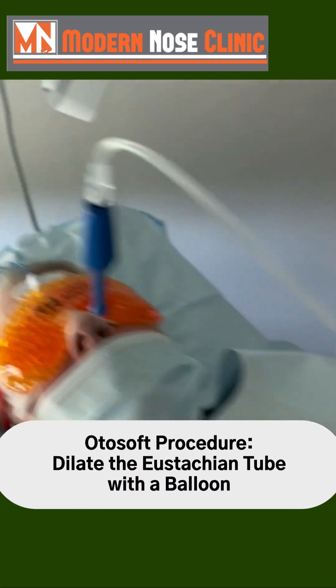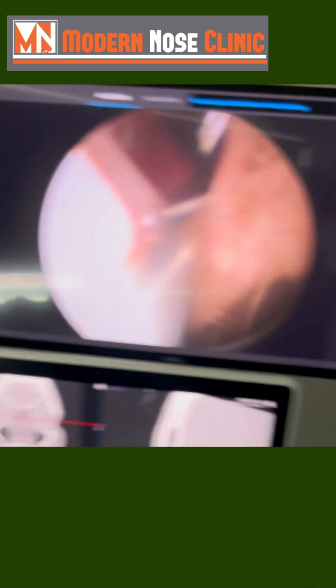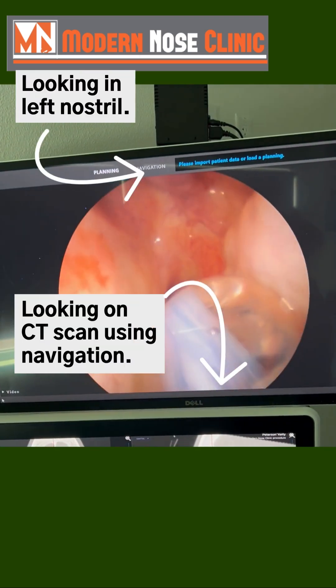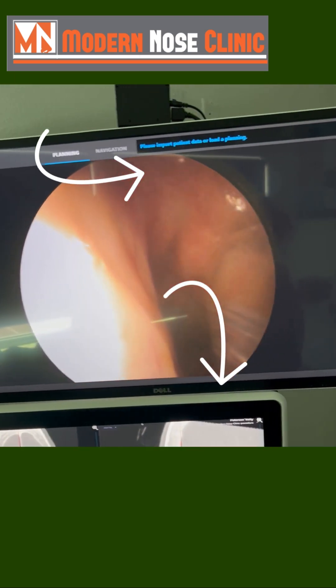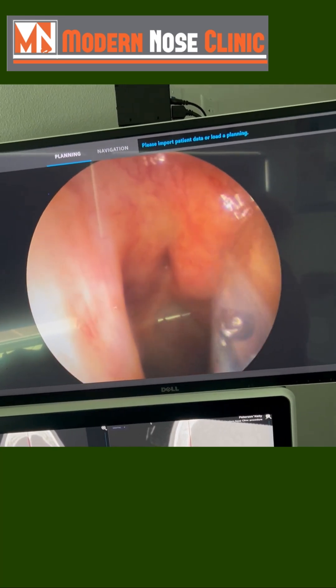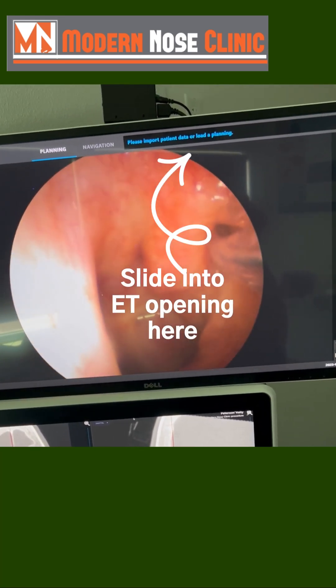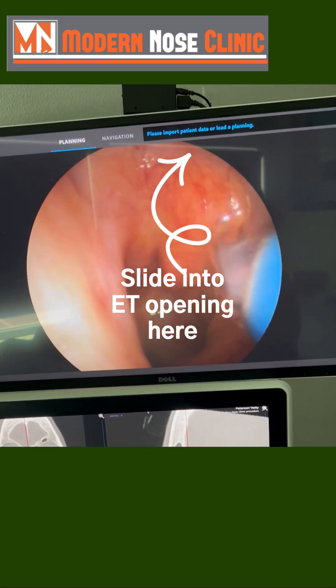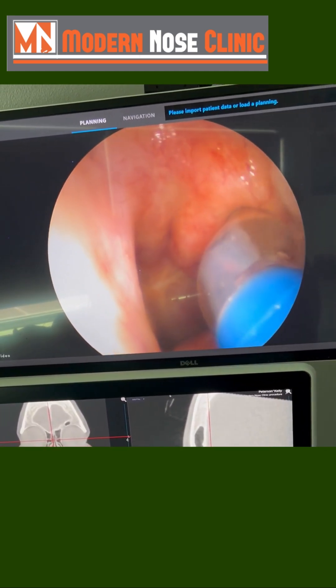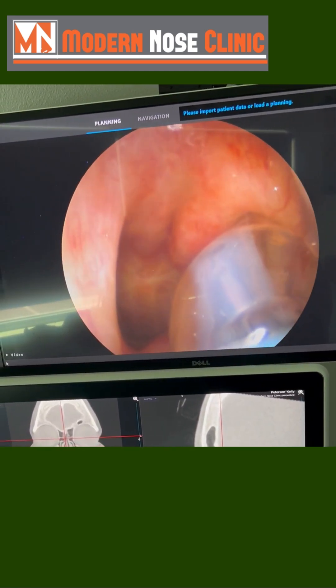This is my patient. She is getting her Eustachian tube dilated. You can see going on down here — there is the opening of the torus tubarius. You advance this dilation device right up into it, inflate it, and you do that for two minutes, then deflate.